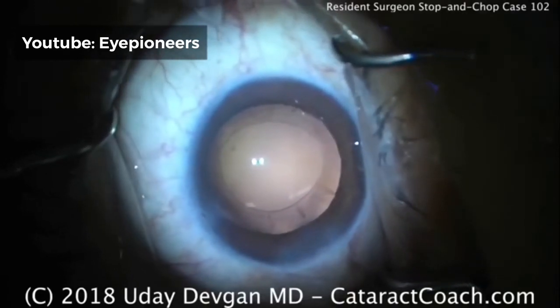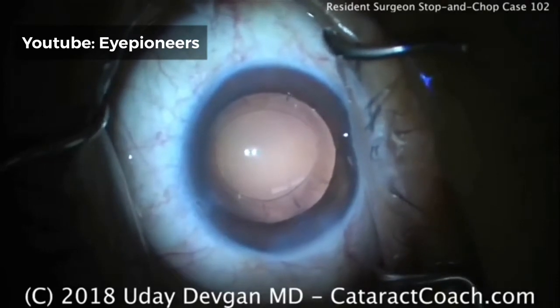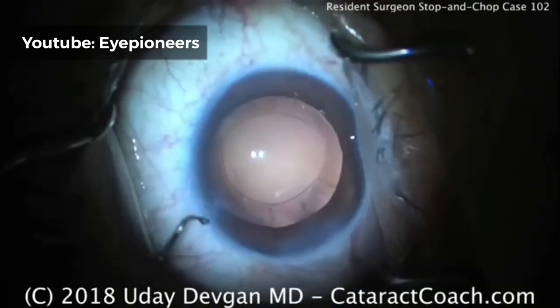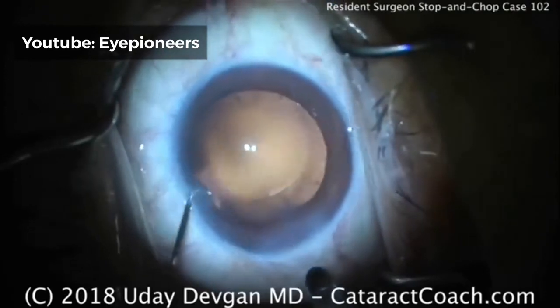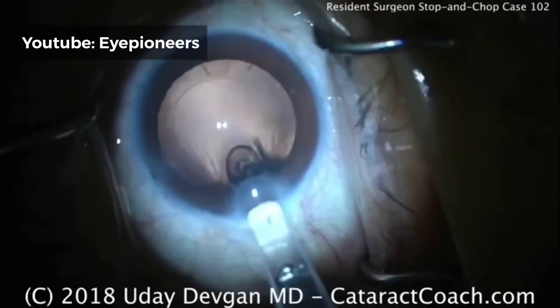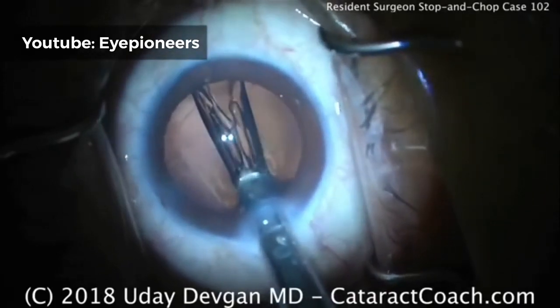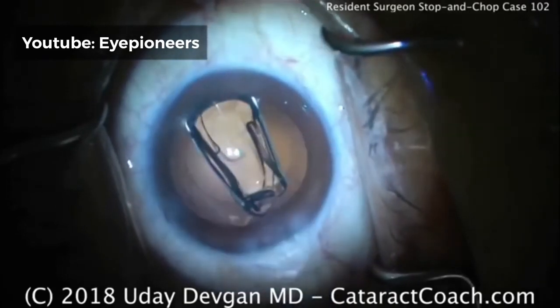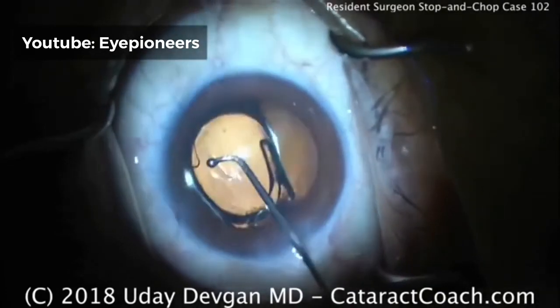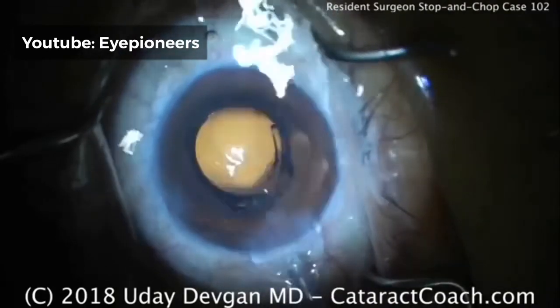The video will run in real time now — the resident is loading up the IOL. These young doctors don't have any presbyopia, so they can load the lens perfectly fine without the microscope. Here comes the lens — fixating the eye with the chopper, putting the injector tip inside the incision, and delivering that lens into the capsular bag. That looks great. Underneath the nasal rhexis, slowly delivering the lens — beautifully folded.